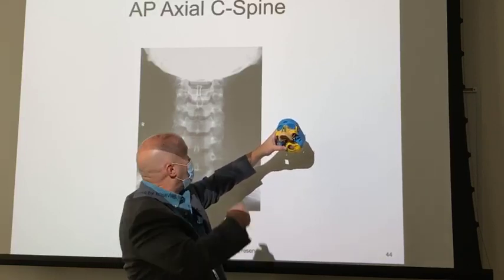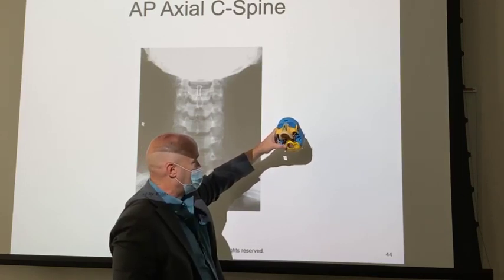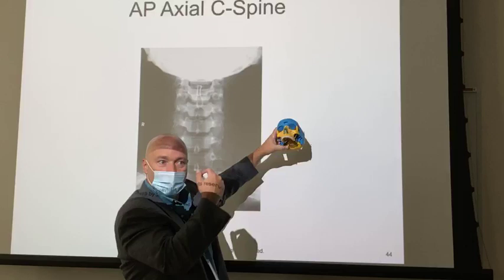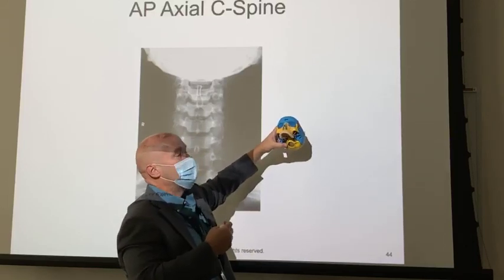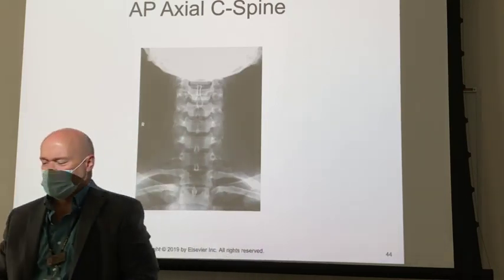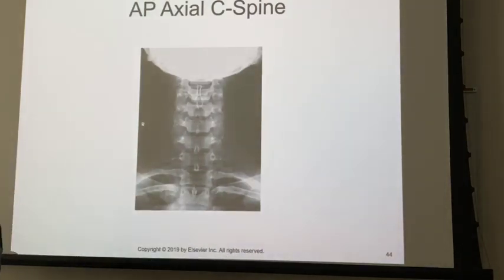As opposed to what we've got going on here, you don't see any teeth, but you see the base of the skull, right? So what they've got going on with this one is the chin is too far extended, right? So the chin is too far back. It's not bad. It's not bad. It's just not ideal. It's not textbook worthy.